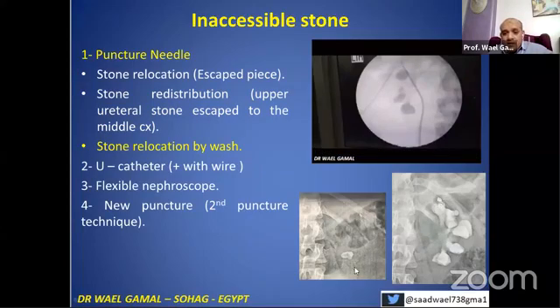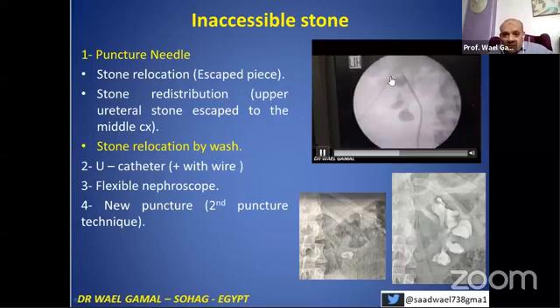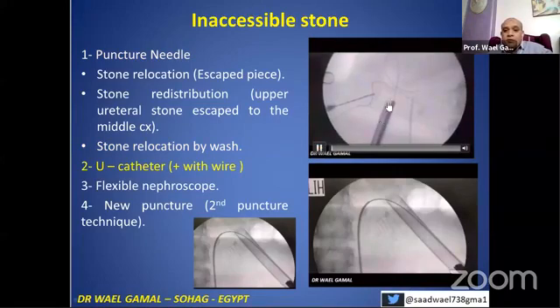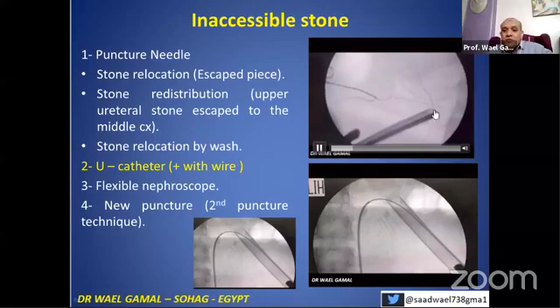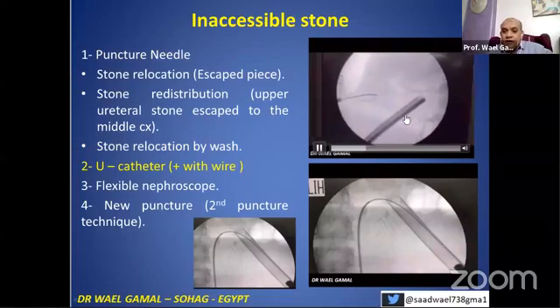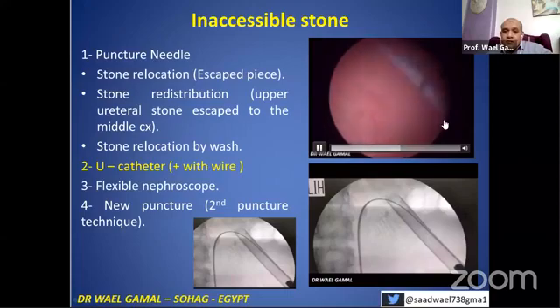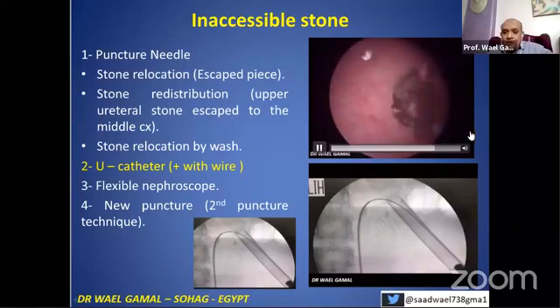There is a small stone in the upper calyx and another stone in the lower calyx. We put the needle and inject saline through the needle — you will see the stone is washed by the saline. When there is a stone in an inaccessible calyx, you can inject saline, or if it is small, manipulate it with the tip of the needle. You can also use the ureteral catheter. Here the lower calyceal access, stone passed to the pelvis — inject saline from the ureteral catheter and it will be pushed in front of me. This is extrarenal pelvis; we inject saline so the stone is pushed in front of me and can be removed easily.